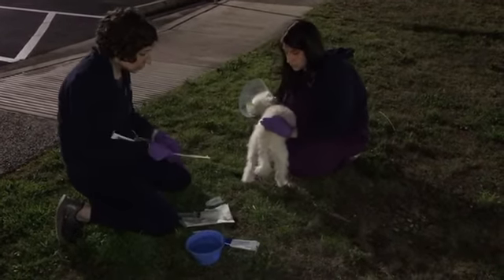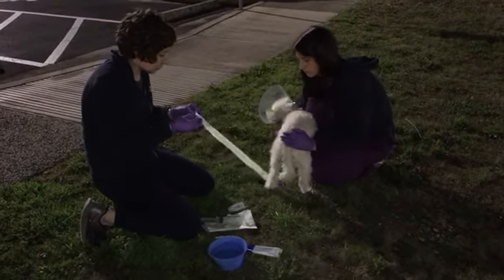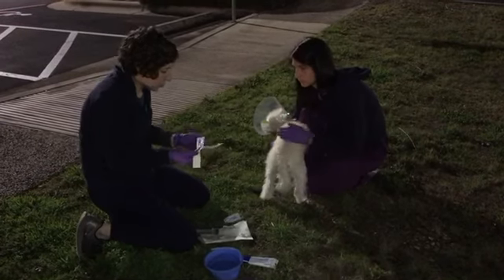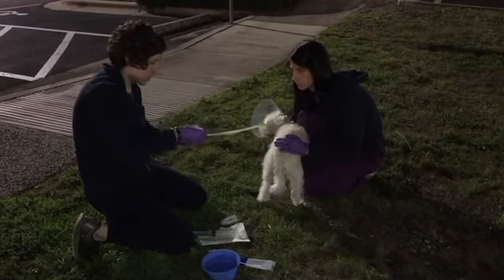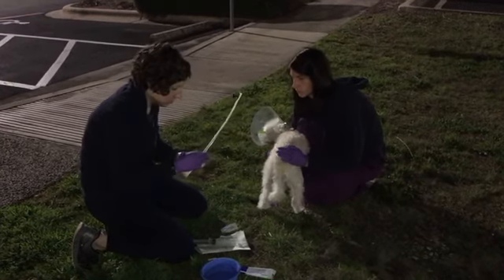So what we're going to do here is I'm going to open my catheter, and I'm going to put some sterile lubricating jelly on the tip.